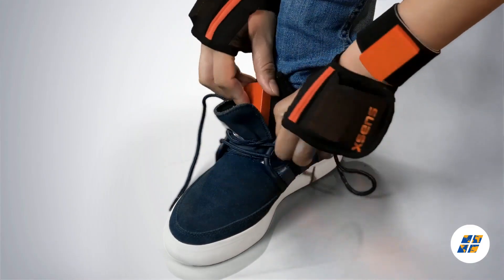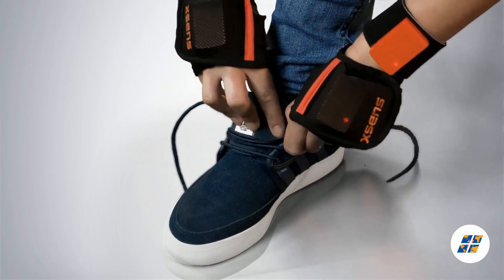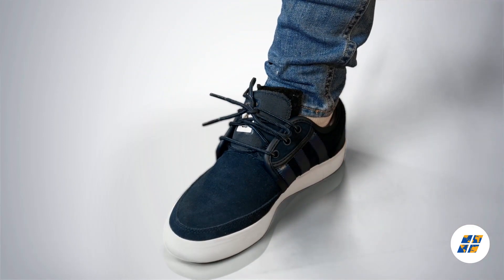Unlace the shoe and place the shoe pad with motion tracker deep under the shoe tongue. Make sure the laces prevent the motion tracker from shifting within the shoe. Repeat the same process for the opposite leg.